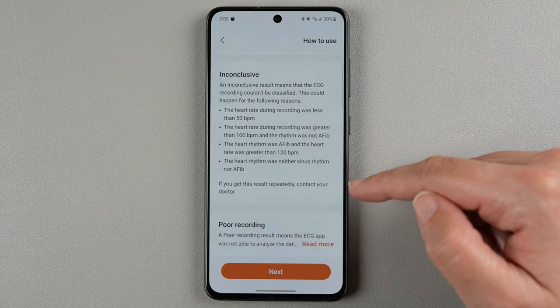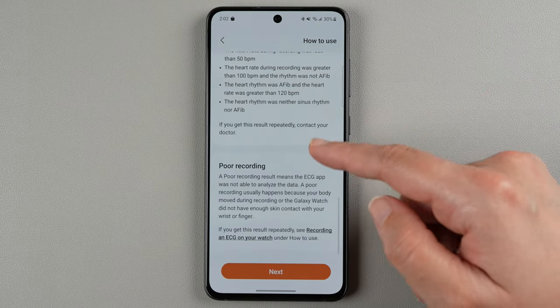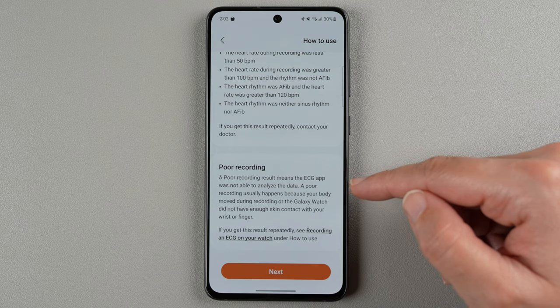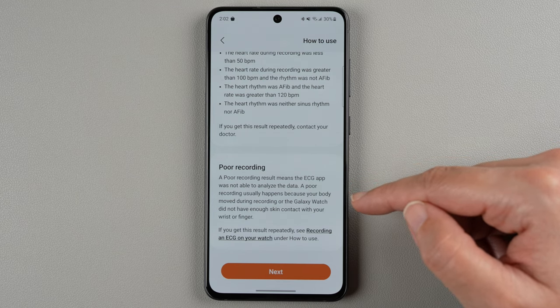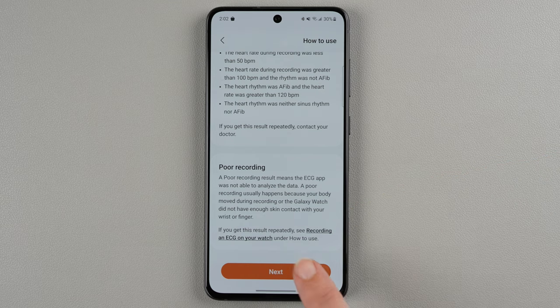If you get an inconclusive result repeatedly, they do recommend you contact your doctor. You could also have a poor recording, which means the ECG app was not able to analyze the data — usually because your body moved during the recording, or the Galaxy Watch did not have enough skin contact with your wrist or finger. We'll go ahead and tap next.